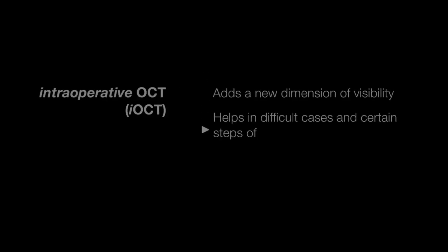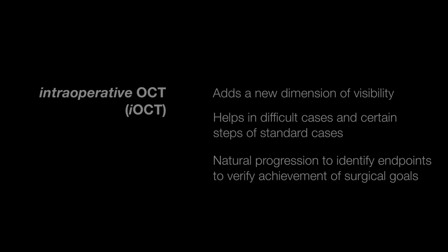Intraoperative OCT adds a new dimension of visibility. It helps in difficult cases and certain steps of standard cases both in anterior and posterior segment surgery. And since most surgeons always request OCT before and after surgical procedures, intraoperative OCT forms a natural progression to identify endpoints to verify the achievement of surgical goals.